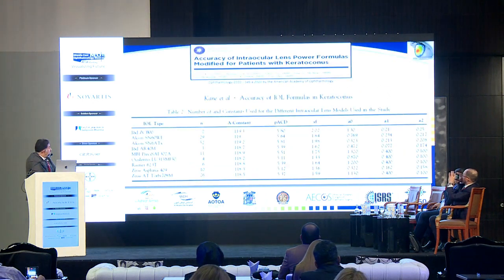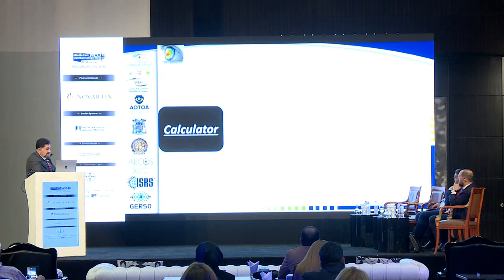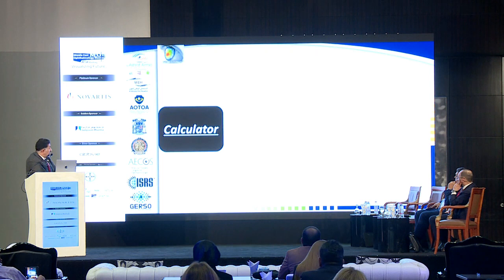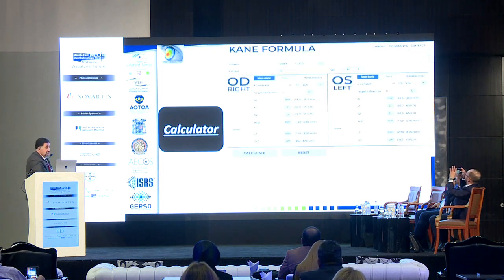This study was in 2020, and they used multiple IOLs and different formulas. In this study they were using a new formula, which is the Kane formula, used with different IOLs, and this is how they calculated with the different IOLs. It was calculated by this Kane formula, and this is the calculator for the Kane formula.